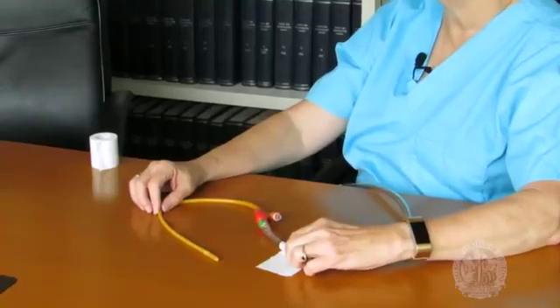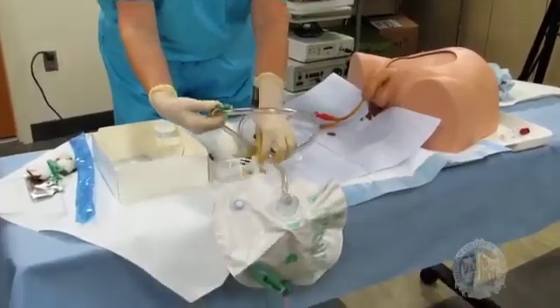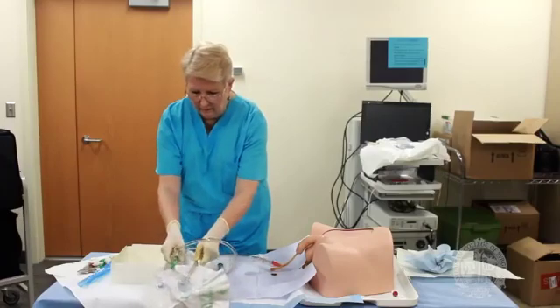Technically, the correct orientation is to secure the tubing so that the penis is cephalad and the tubing is taped to the abdomen. However, many people choose instead to secure the device to the patient's leg. If the patient is immobilized or unable to move, this can lead to ulcers, but it is acceptable in an otherwise healthy patient who will not need the catheter for more than 72 hours or so. Regardless of how you secure the tubing, it is crucial to ensure there is no tension on the tubing. The tubing can then be clipped to the sheets or the patient's gown. The bag should be placed in a dependent position and may be hung by the string or hanger above the bag.